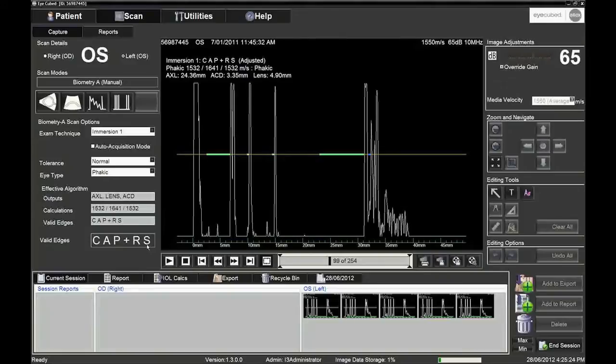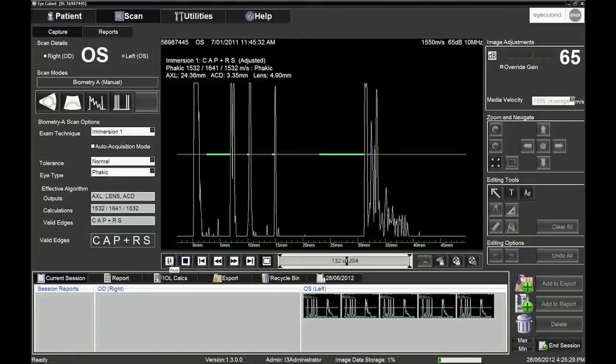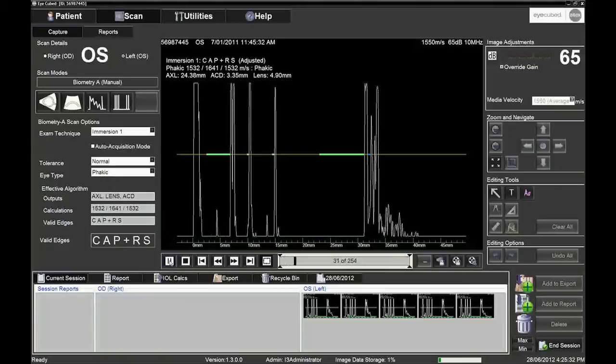At this point, the operator can decide to store the picture using the keyboard or the foot switch, replay the movie and choose up to five images to be used for the IOL calculation.